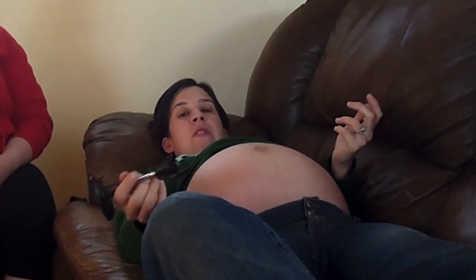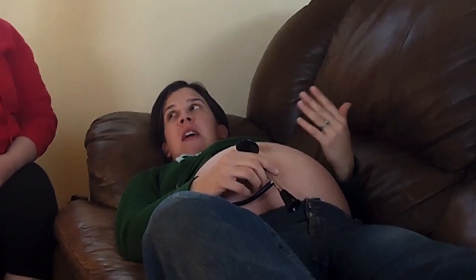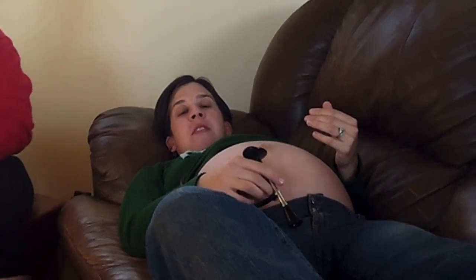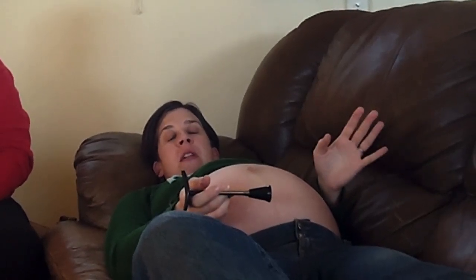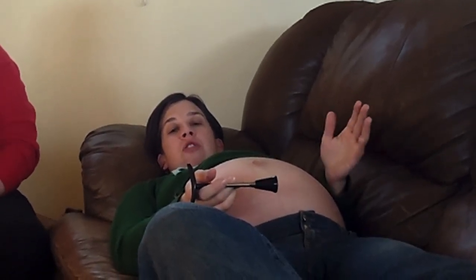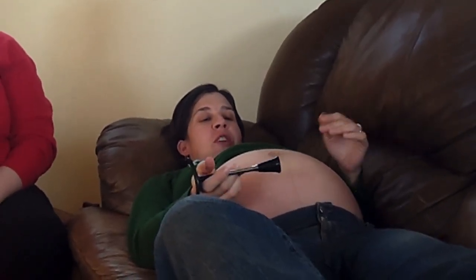A fetoscope does allow you, though, to focus in on the real heartbeat. I think it comes up a lot, with people that we know, is the baby head up or head down? We talked about that on the palpation video. Well, heart tones and location can assist in figuring that out. It's not the be all and end all, but if a baby were truly breech, then in a normal breech circumstance you'd expect those heart tones to be a lot higher. And again, it's learning the sound of the actual heartbeat, because you can hear things all over.